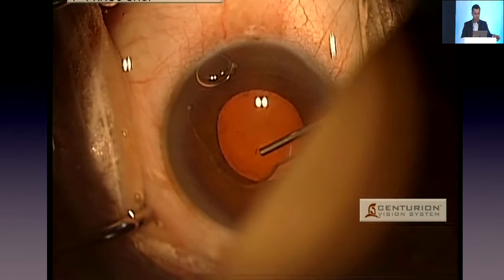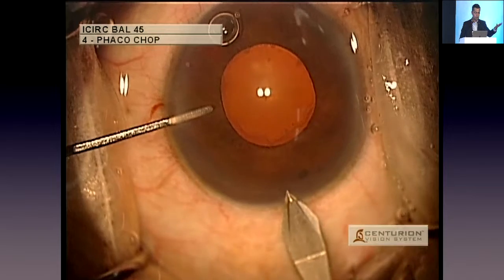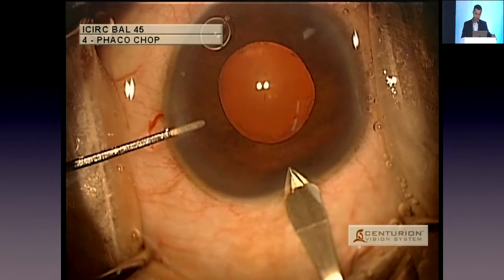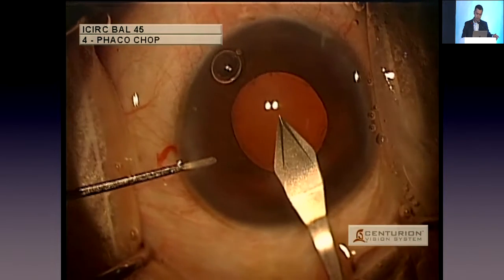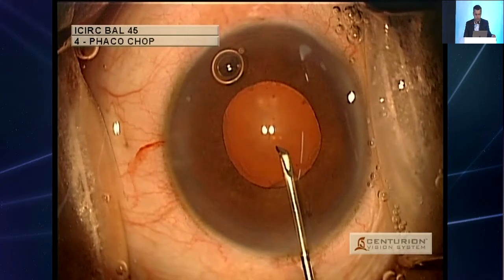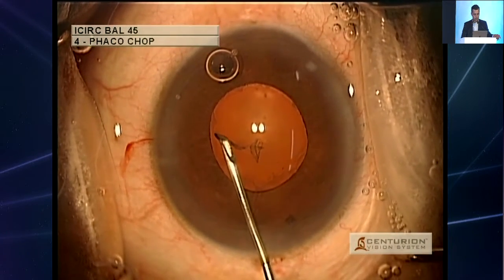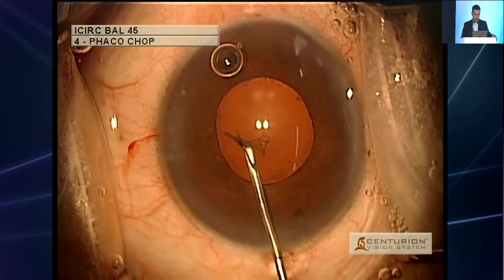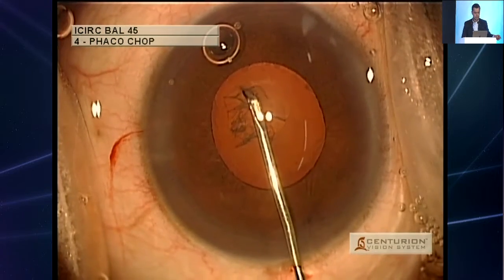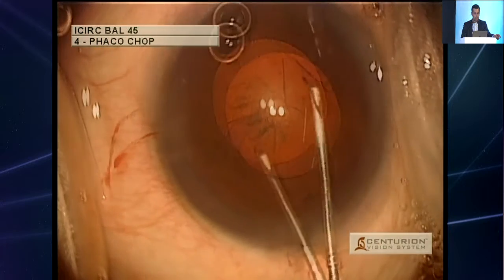My choice of viscoelastics is always to use a soft shell technique with dispersive viscoelastic like Viscoat on the top, followed by a cohesive viscoelastic that pushes the dispersive and sticks it to the endothelium. And my choice of incision is a 2.4 millimeter incision or a 2.2, depending on the lens choice. So this is a fairly decent opening of the pupil, as you would say, and I start my rhexis. And with viscoelastic, if you don't change your viscoelastic, generally your hands are very stable and you can pull a rhexis edge to edge without really worrying too much.